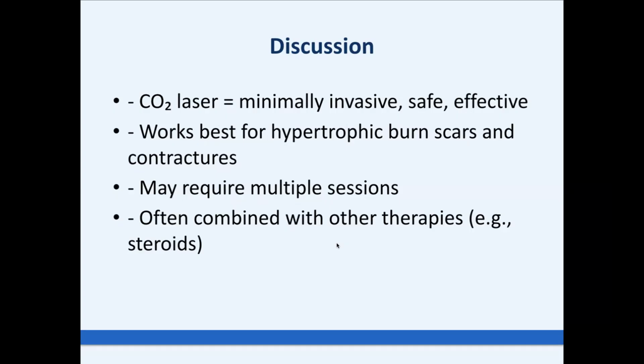Yes, we will have not only one procedure, but 2, 3, or more, depending on the patient's case. It works best for hypertrophic scars and contractures, but truthfully, for contractures, I think the best way is also surgery. It may require multiple sessions, which is a minus, but it's not very bad. It is often combined with other therapies. I think that's all.